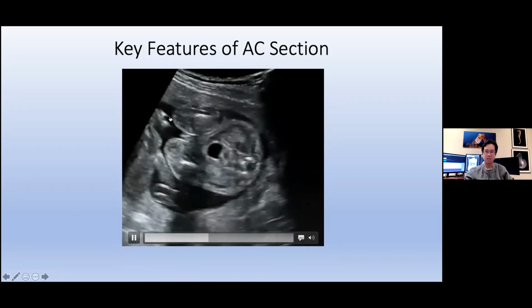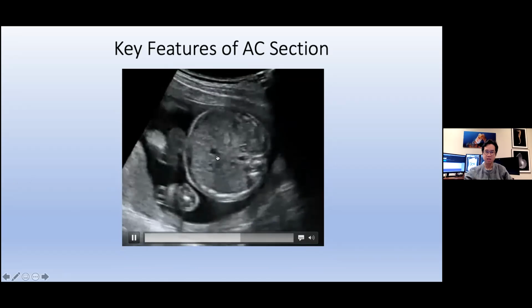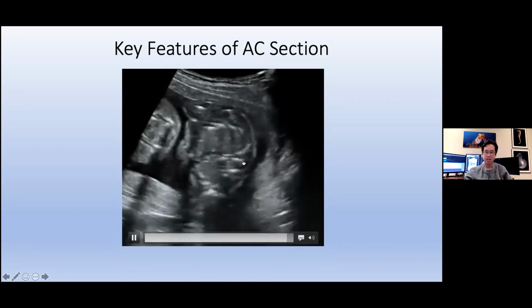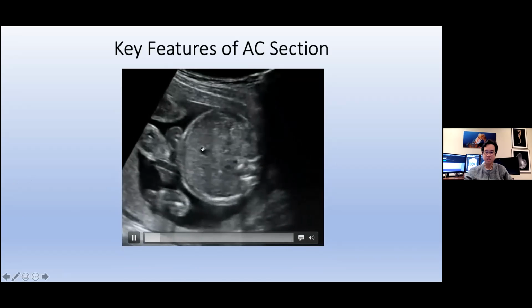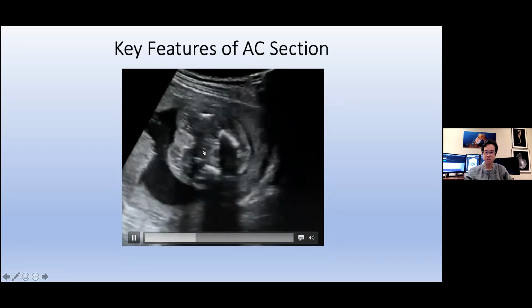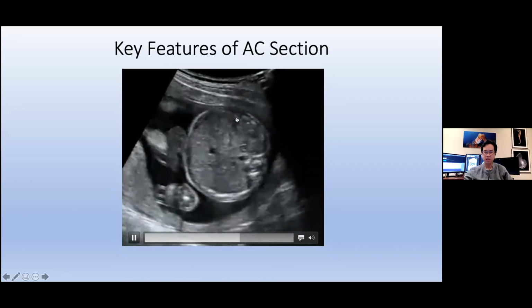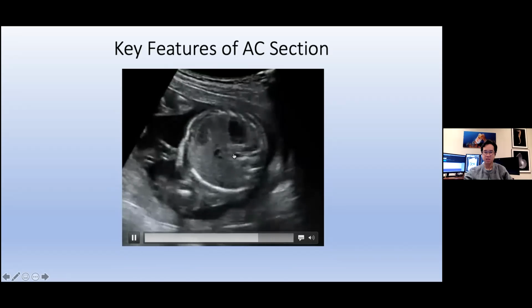So this is a sweep through the fetal abdomen. Okay, so just some of the structures that you may see, this little thing here, when we come back to it. So fetal heart here, 4 chambers. This is the spine back here, right? This right there, that's your umbilical vein as it comes down. This is your bladder. And then we're going to sweep back up, bladder, umbilical vein, gallbladder there. You see your stomach, and then your heart. Okay, this is aorta right there.